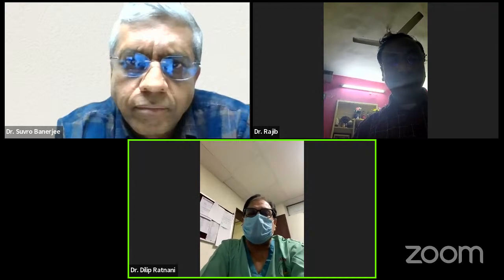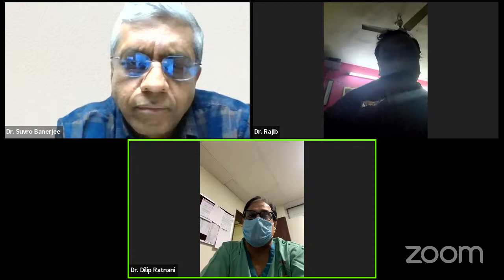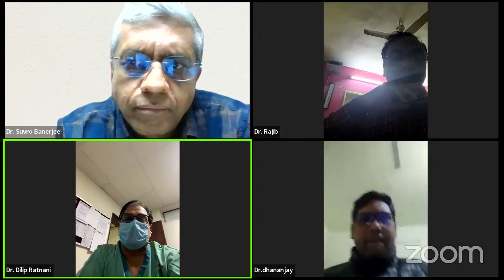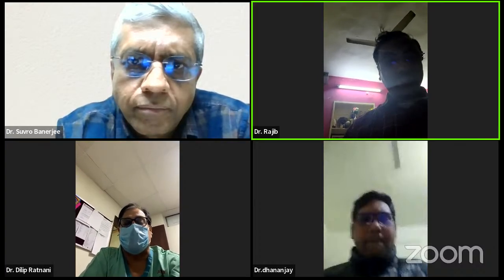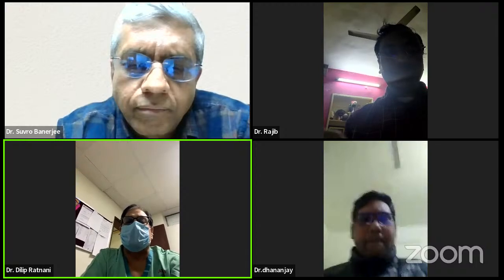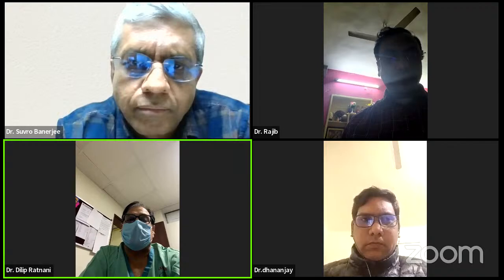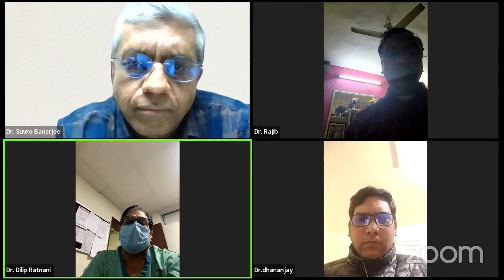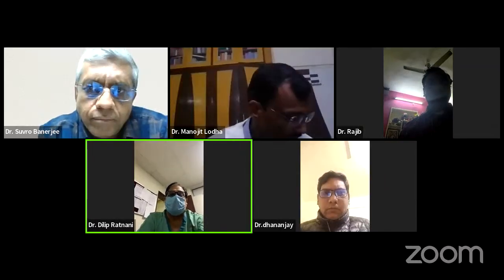I usually use the export catheter. I do a lot of thrombus extraction first, and after seeing the distal vessel clearly, only then I put in the stent. It helps me in preventing no flow and slow flow phenomena. And whenever slow flow or no flow is there, nitroprusside does wonders if you give it through the thrombus extraction catheter or through a ruptured balloon.